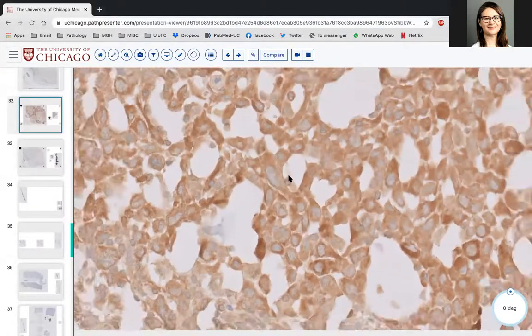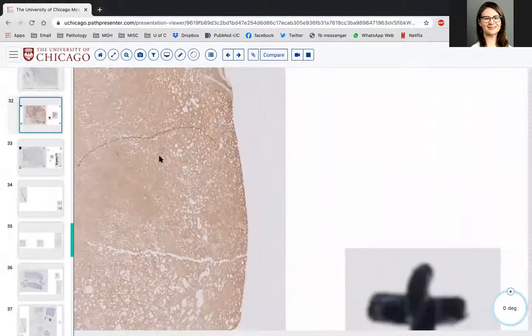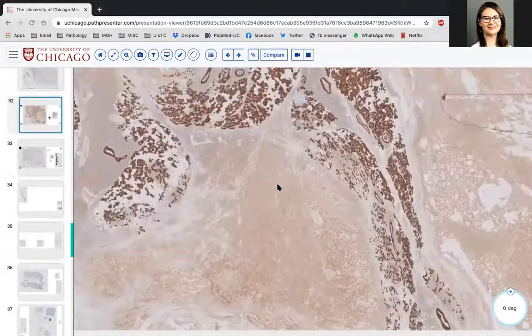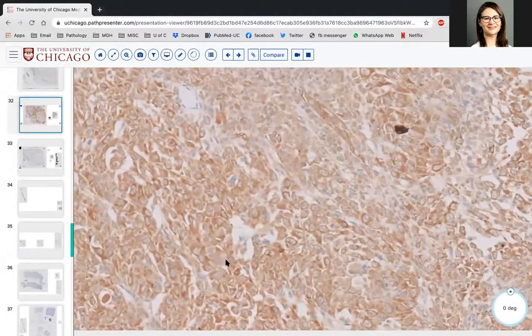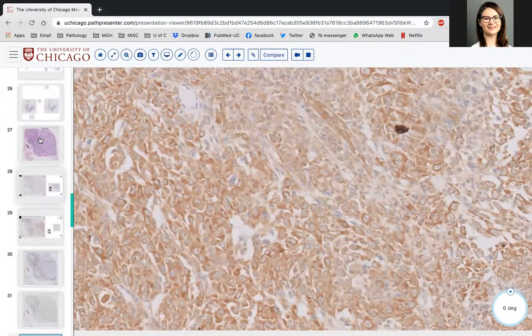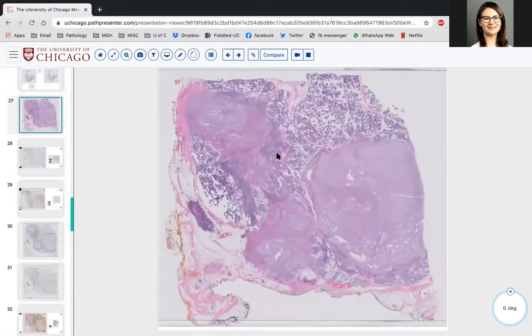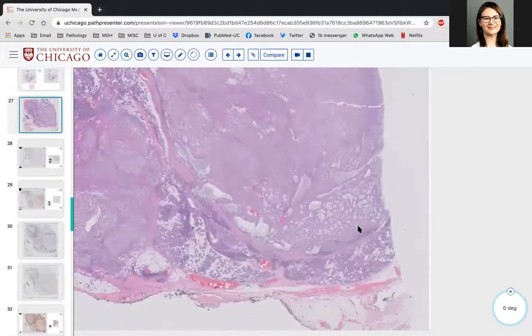All right, so what's your diagnosis? Or do you still want more? So we started with, right, we started with this and we ended with this. No one? No one has a diagnosis?